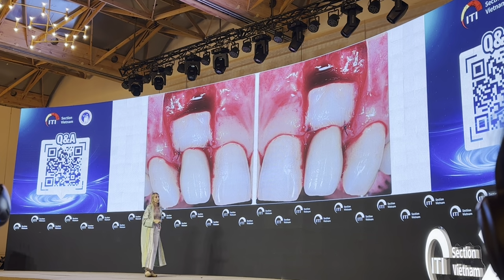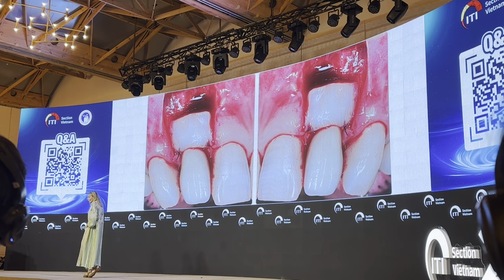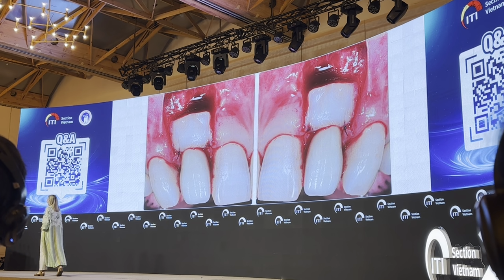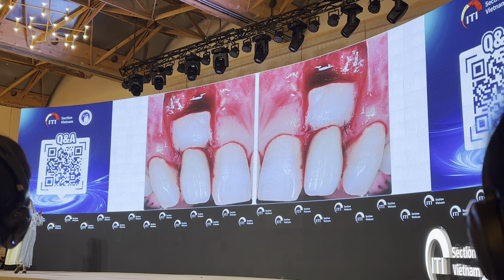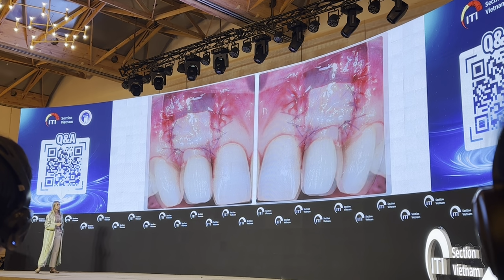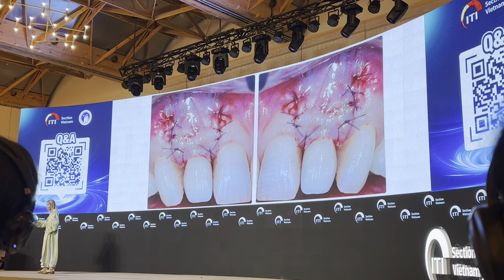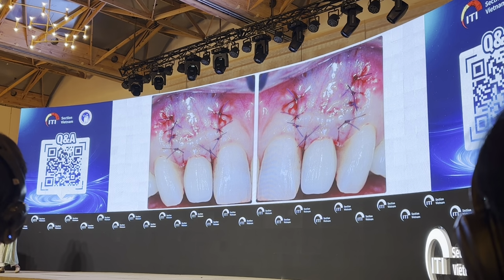The implants are both well osseointegrated. The crown is in the right position. The papilla were quite good, so I can simply raise a flap, which in that case is a trapezoidal flap, because I need some more coronal advancement, because I have an apical shift of the mucosal margin, differently from the previous case. The connective tissue graft should be completely covered by the coronally advanced flap that is going to change the position of the mucosal margin and completely cover the connective tissue graft below.